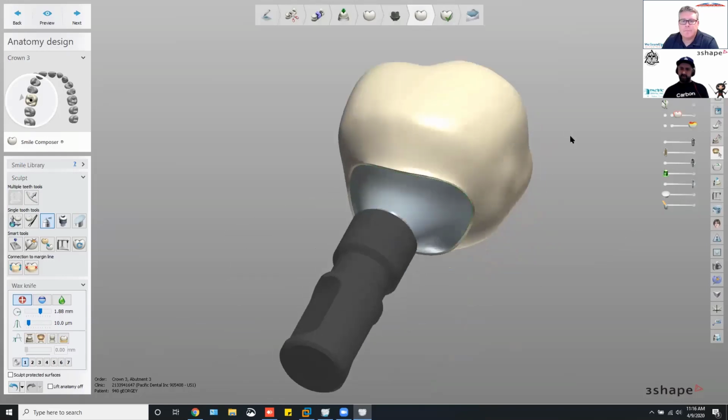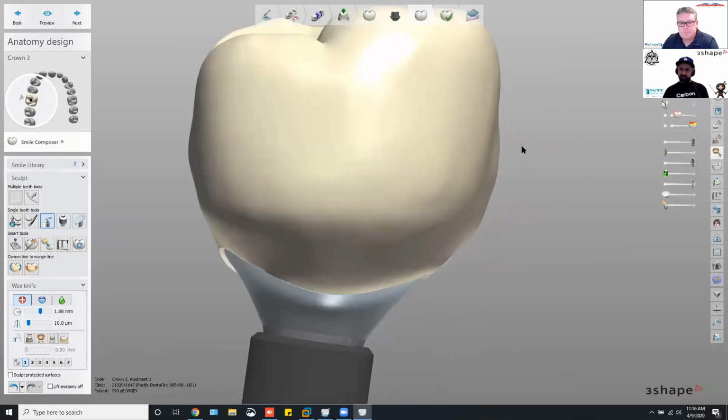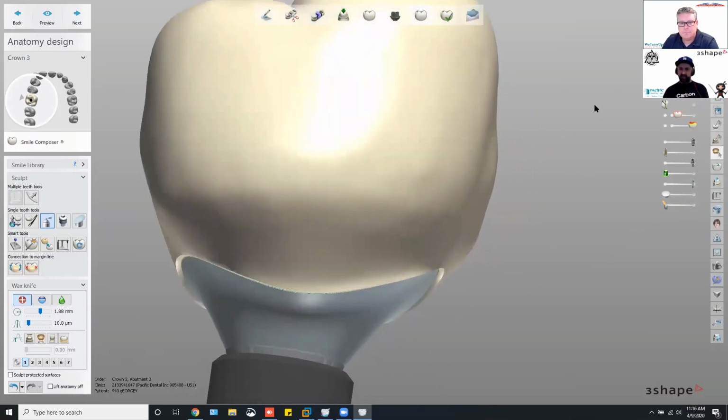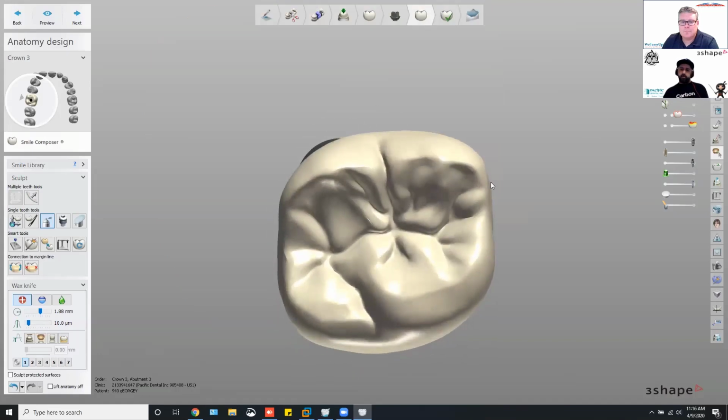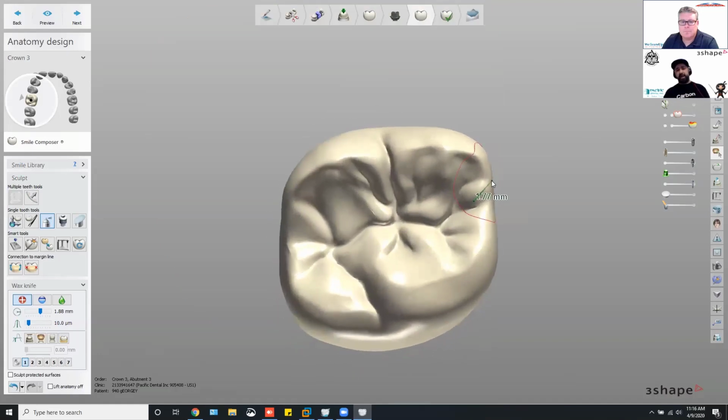But when I give it to my designer, you can see right here that there's a C contact, and he's going to have to sit there and grind all this, and the fitter is going to take hours, and now he's going to lose production. So on the design side, everyone's flying and making everything look good, what they think looks good, but then the guy fitting it is miserable to do it.